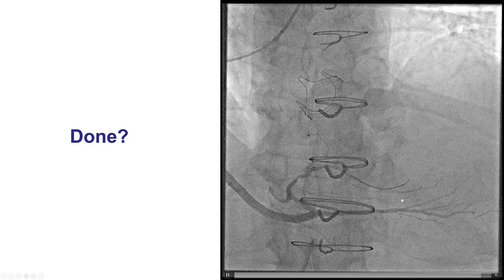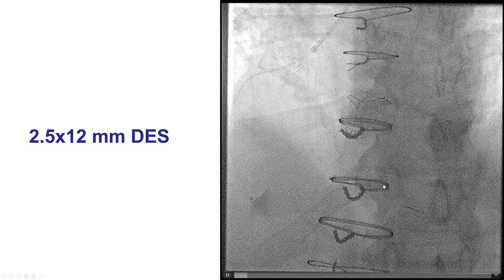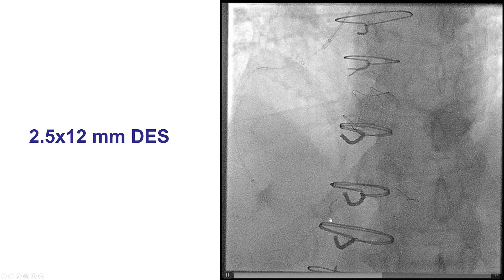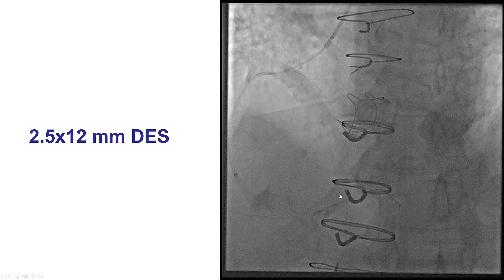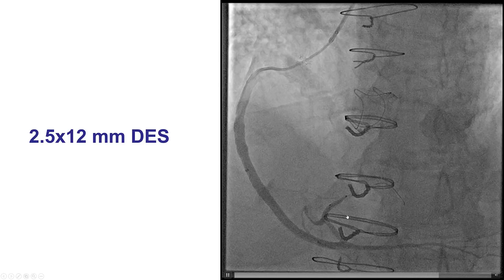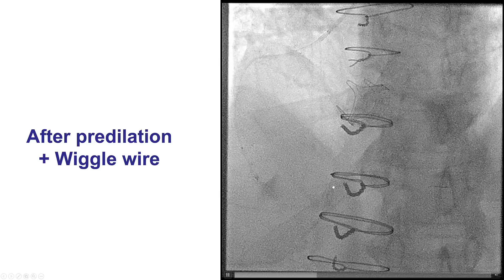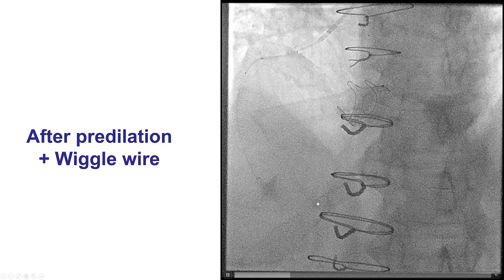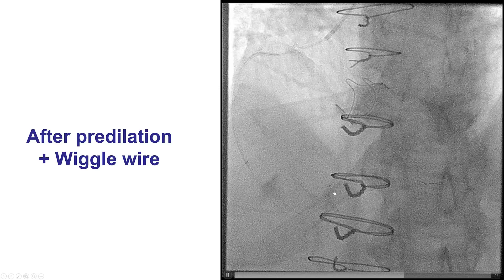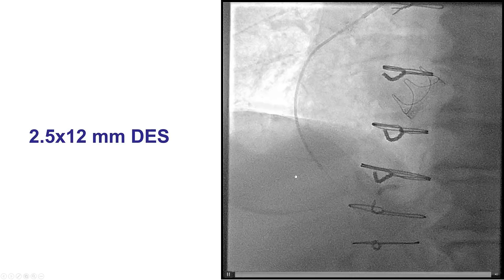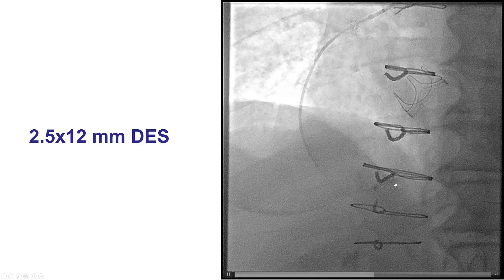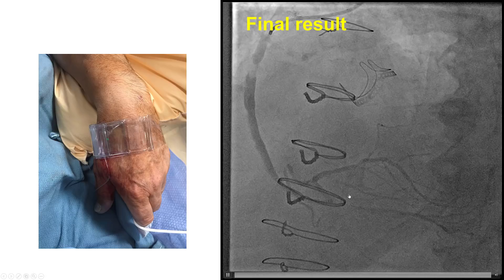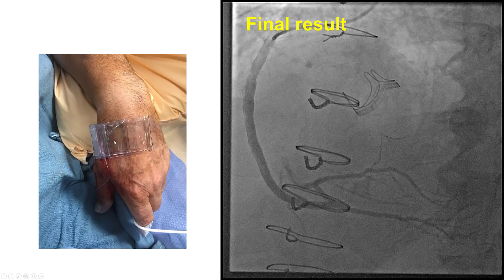We thought we might be done, but there was a pre-existing lesion in the posterolateral vessel that we had not paid attention to initially due to the severe ostial PDA lesion. It still appeared to supply a fairly large territory, so we decided to treat it. We made the mistake of trying to stent it without additional predilatation, resulting in inability to deliver the stent — no surprise given the calcification and multiple bends. When delivering through previous stents, the Wiggle wire is extremely useful: its zigzag distal pattern helps get off stent struts and provides good support. Using the Wiggle wire, we delivered a 2.5 by 12 mm stent, achieving TIMI flow into the posterolateral and PDA, with successful hemostasis on the distal transradial access site.